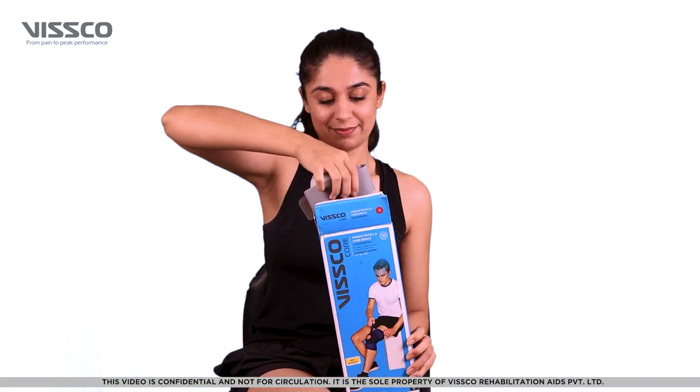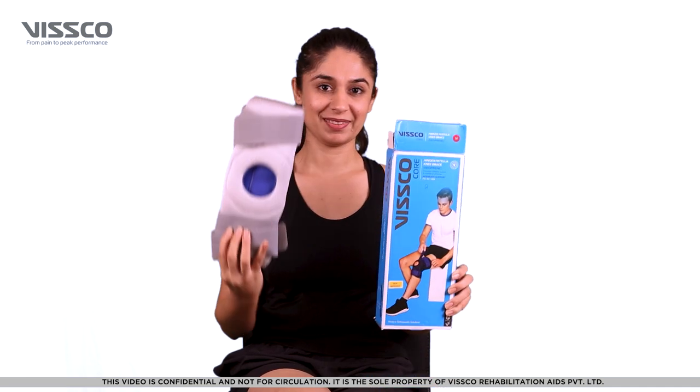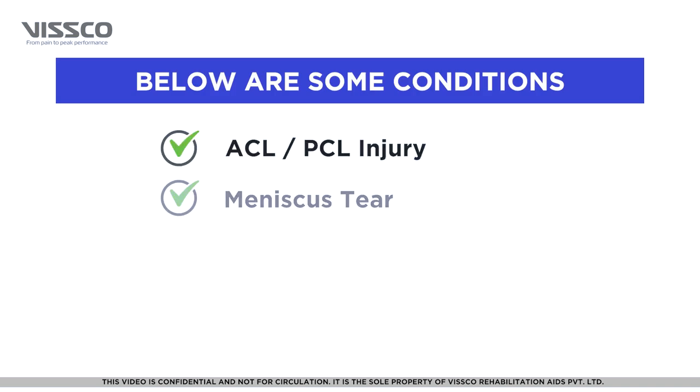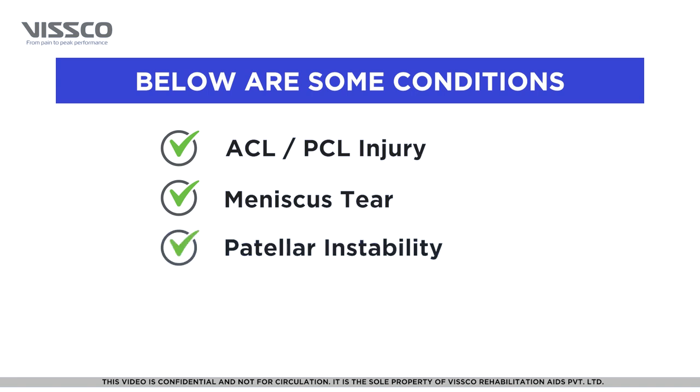The VSCO Neoprene Hinge Patellar Knee Brace provides support and stability to the knee joint. It can be used in case of ACL-PCL injury, meniscus tear, and in case of patellar instability.